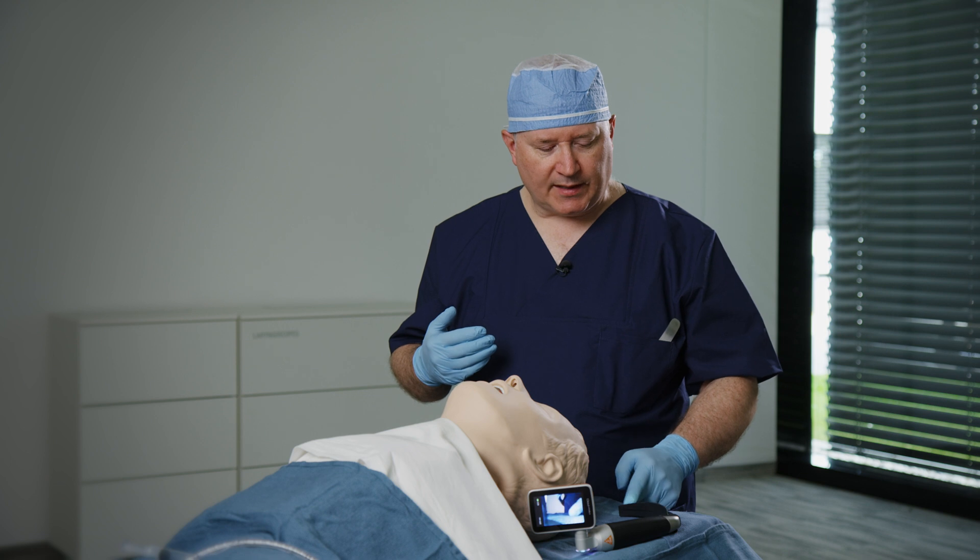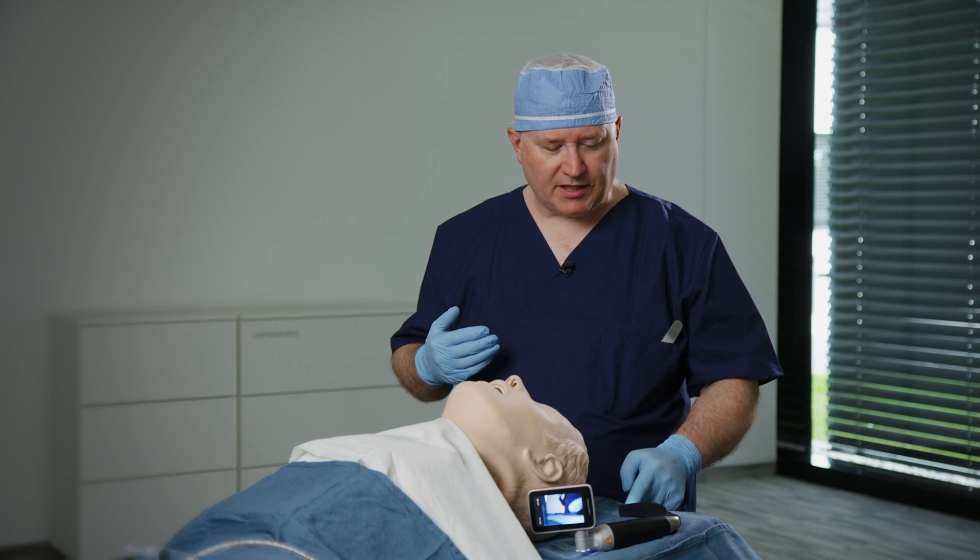This is a combined direct laryngoscopy and video laryngoscopy device with disposable interchangeable blades.